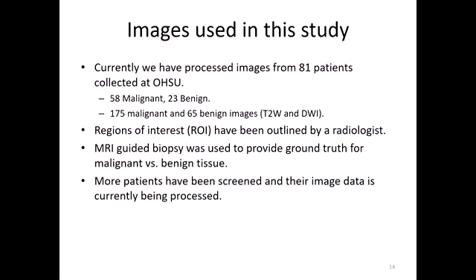Do you have a different number of images per participant? I have a spreadsheet for that, yes. It varies per person. So we have, for instance, some patients with 7 T2 weighted images, and other patients may have 3 T2 weighted images. So the relative size, that sort of thing. Mm-hmm.